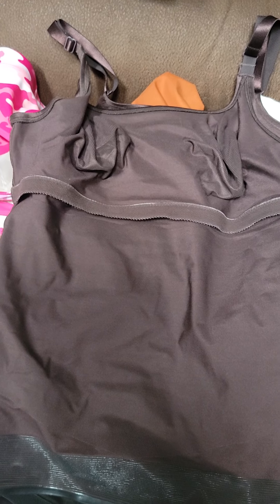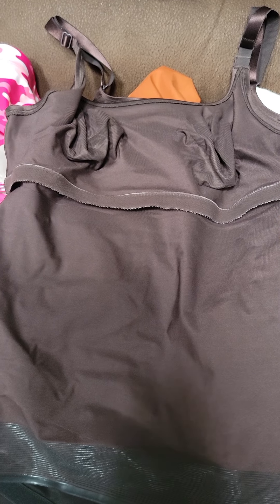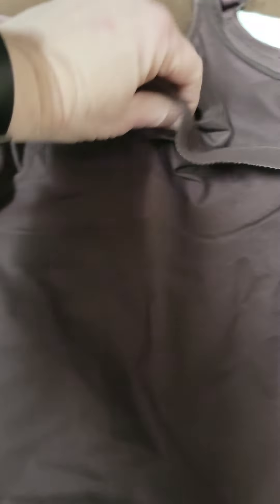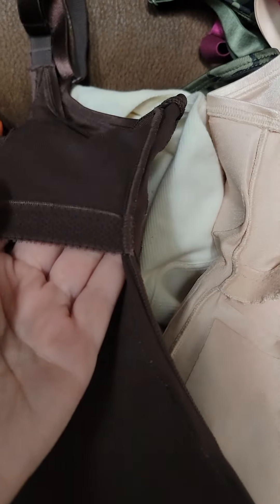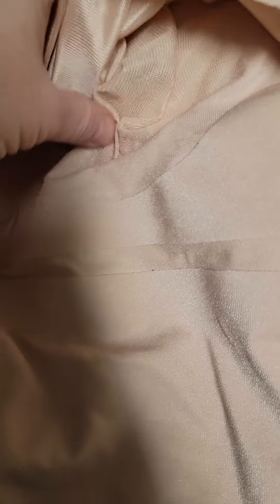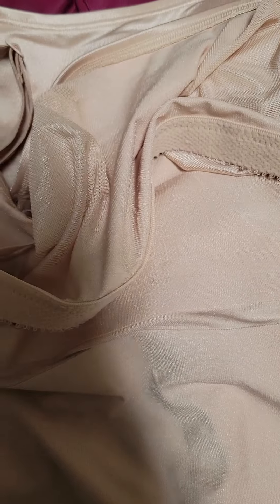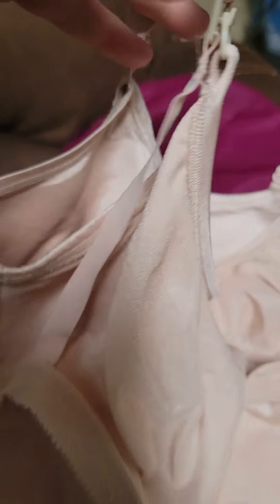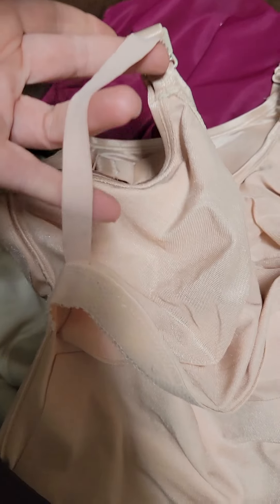This is the Ultimate, the level five. You can see it is attached here — they call that a sling. It's thinner over here, and this layer is as well. This is the nursing one, and it's got hooks and then this little sling thing here.